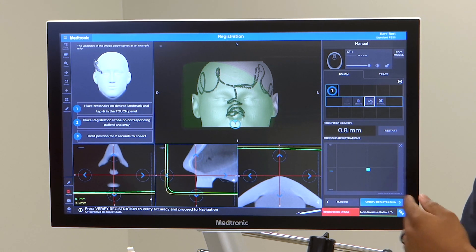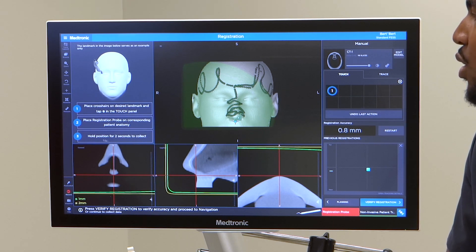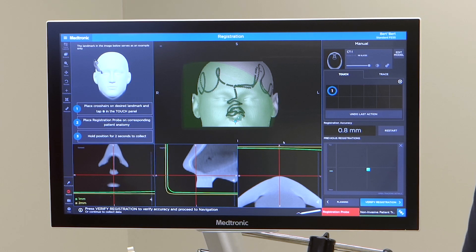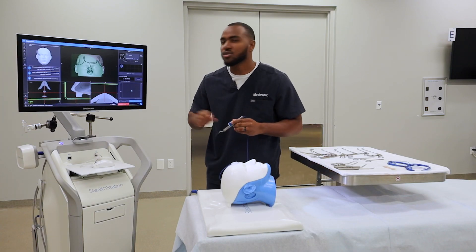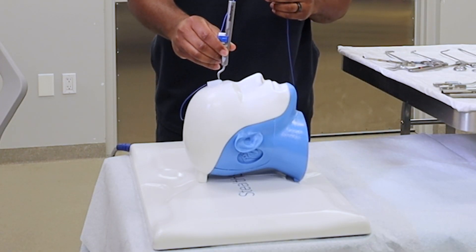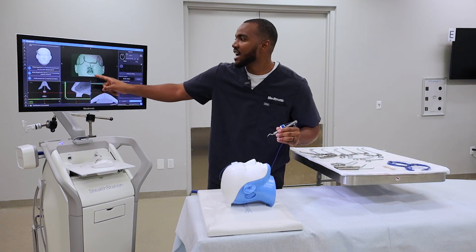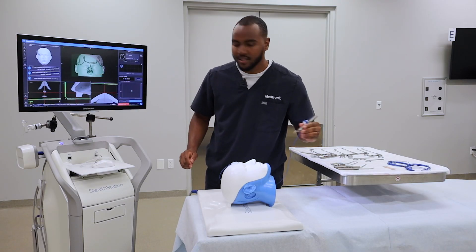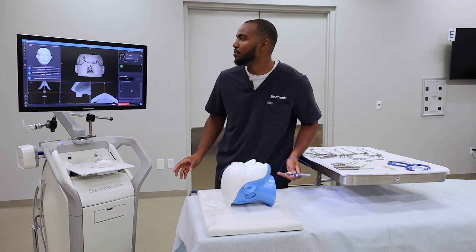Once you refine that point, you can hit Save. Then you're ready to hold the position for two seconds. With the registration probe, you'll want to make sure it's verified — I just re-verified mine. Then that point, exactly as it is on the 3D scan, you want to touch the patient lightly until you hear that bloop sound.